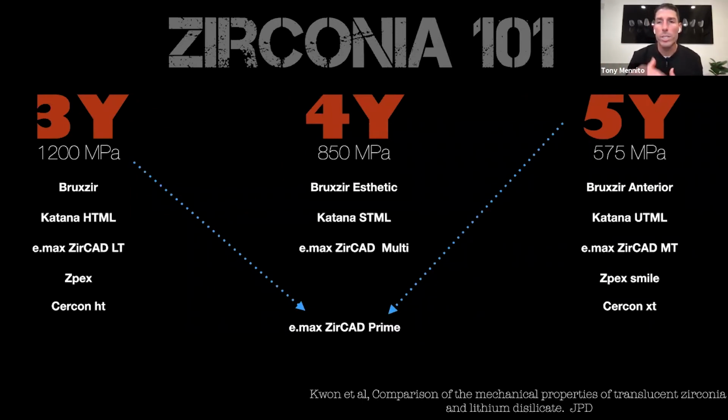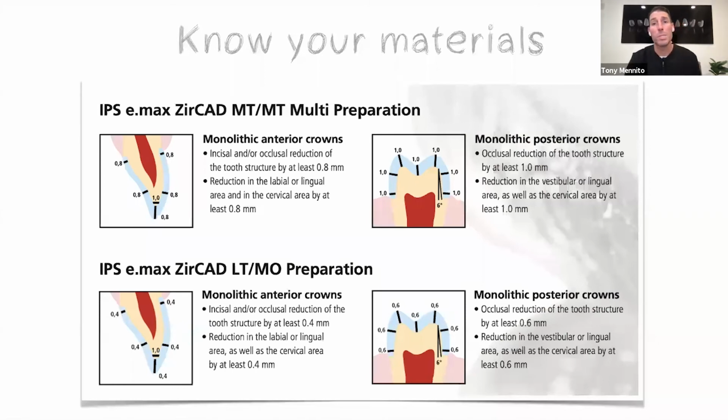They can actually layer different types to get strength in certain areas and aesthetics in others. So it's a really exciting time for dental materials. But like anything else, you've got to know your material.